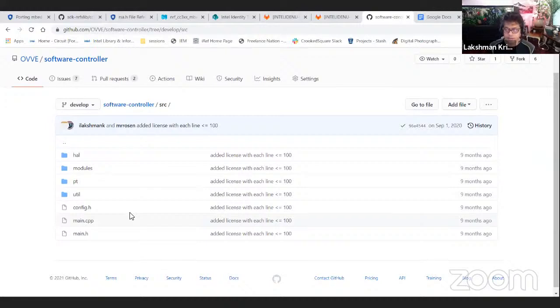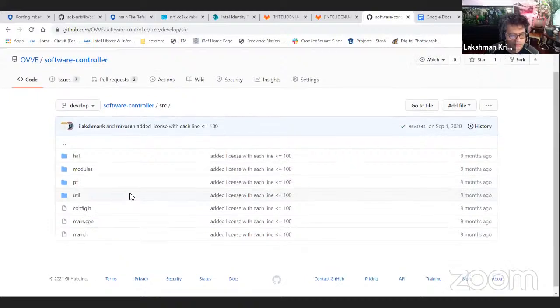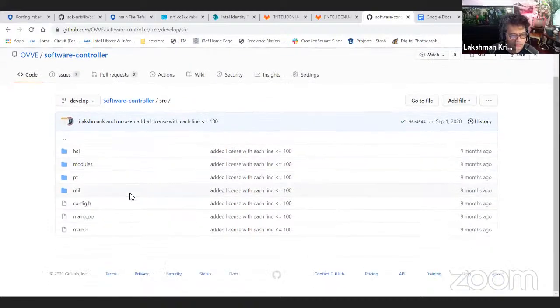But just from a high level, the overall design constraint we were working with was an attempt to write all this code in such a way that it was as robust as possible, but still able to compile it using the regular Arduino tools. So you wouldn't need anything special to do that. If you're used to embedded firmware design, you might be wondering why some things are the way they are. But that was the constraint we were working with.